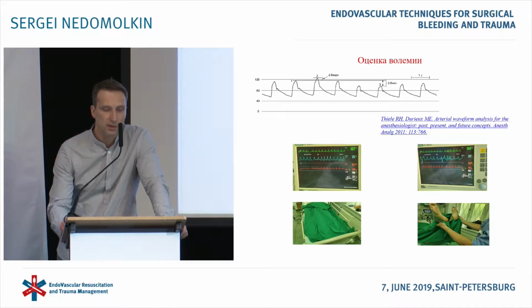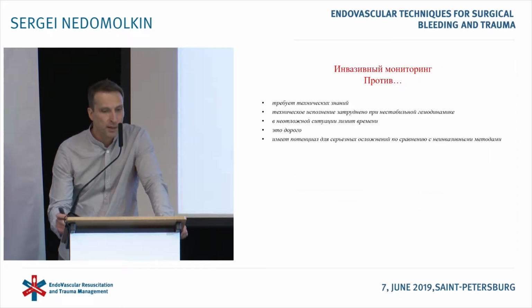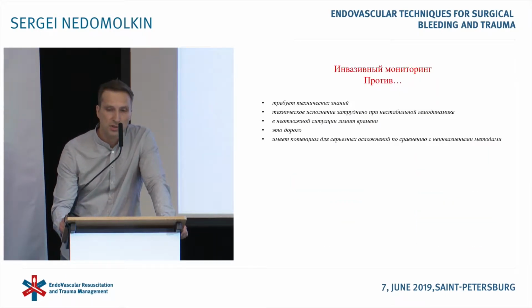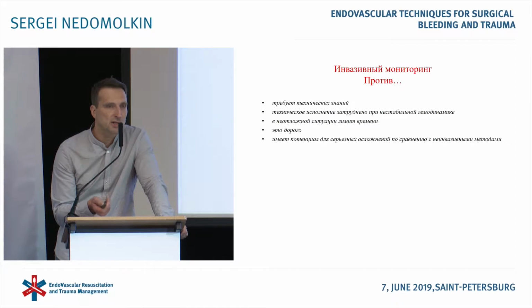Well, we see that as the systolic pressure is changed and the heartbeat is changed, we can assess the volemic burden of the patient. The factors against invasive monitoring are as follows.